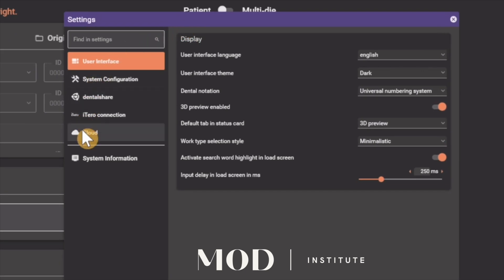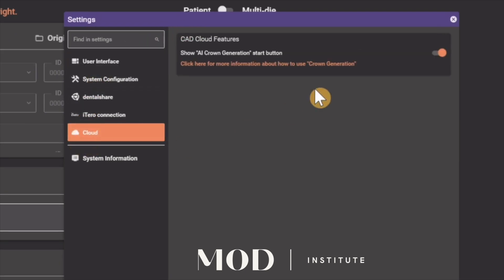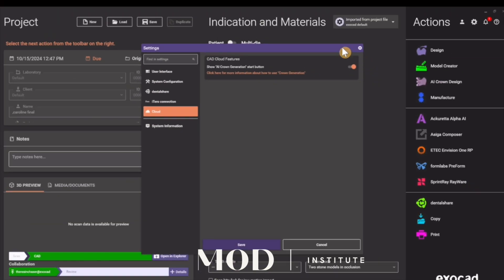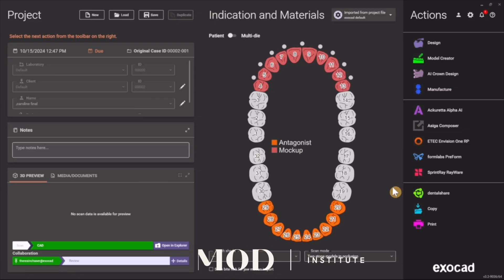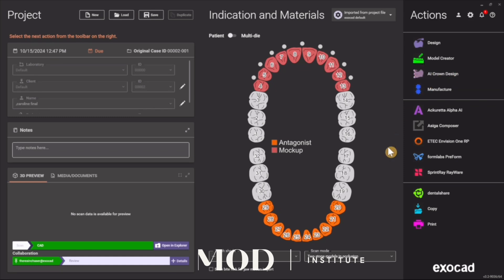Go to your settings, go to Cloud, and turn on cloud AI features — or cloud features — and hit Save. Then close dental DB and reopen it, and when you reopen it you should see an AI Design button.